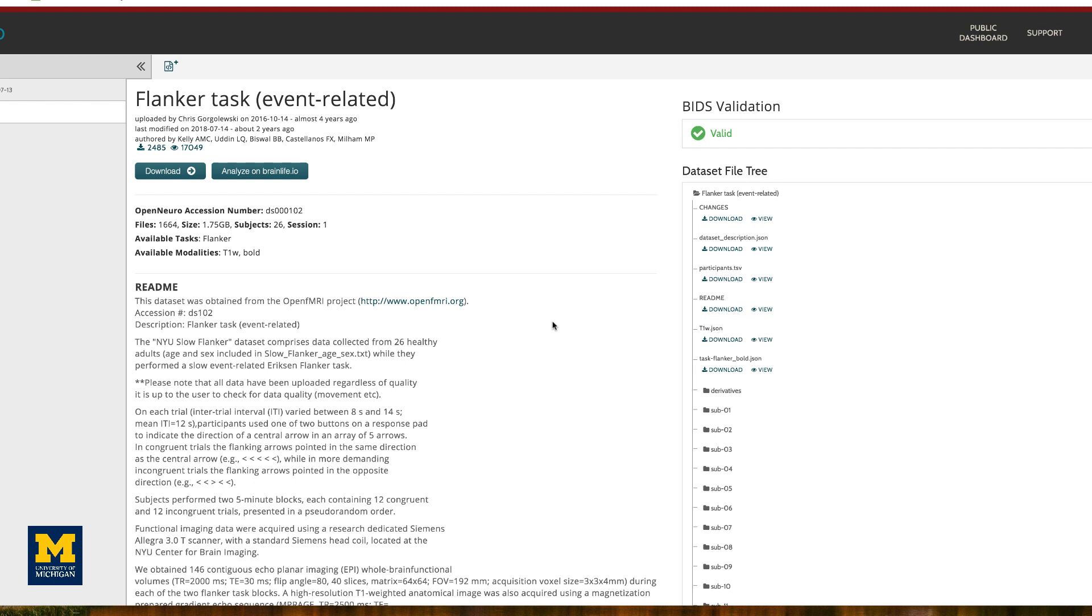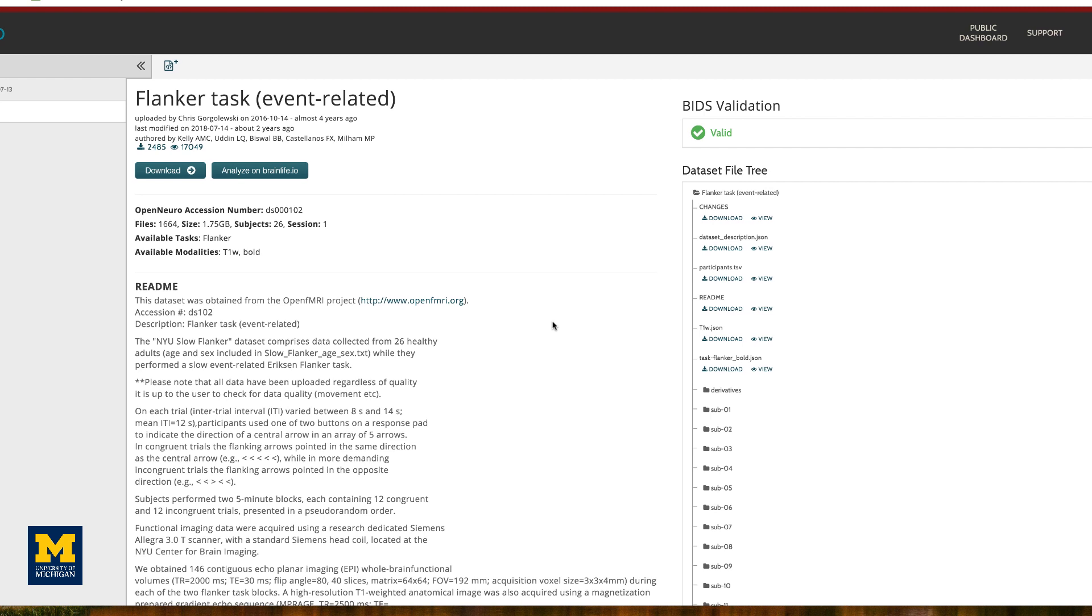The data set can be found here on the OpenNeuro website, an online repository for neuroimaging data.